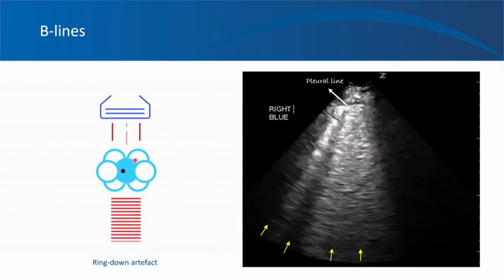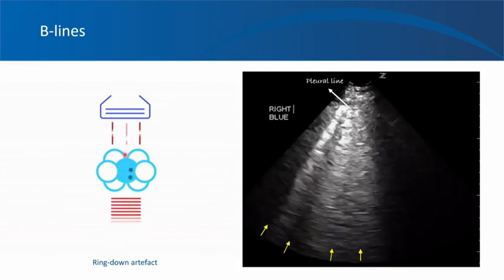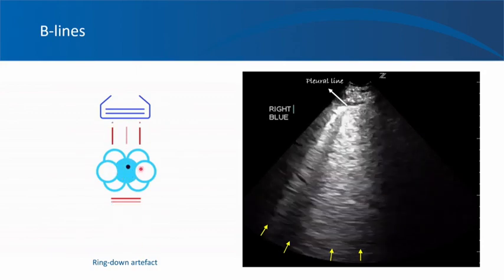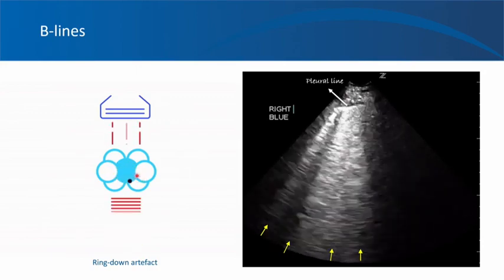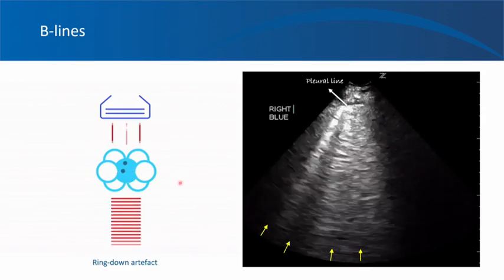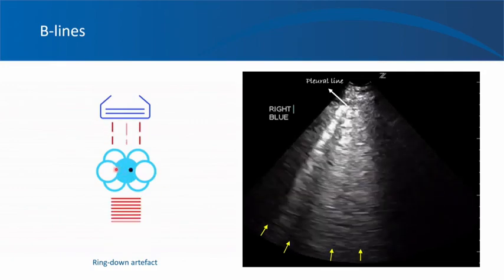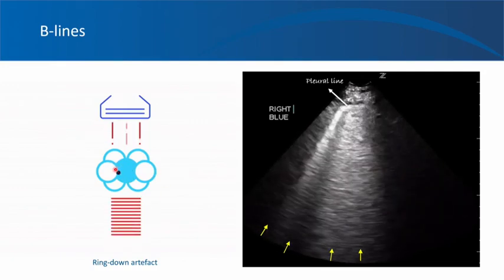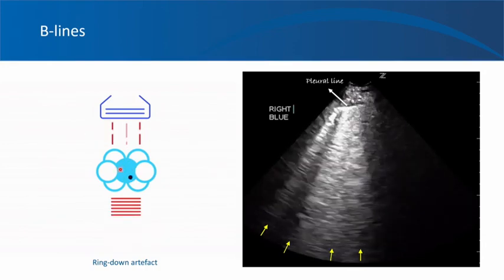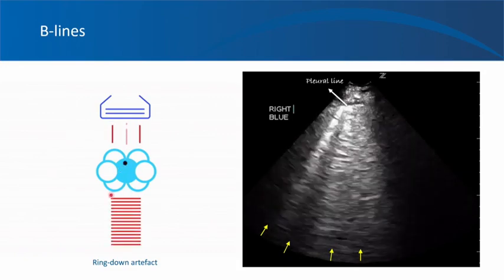That means when there is fluid in the interstitial septa of the lung that is surrounded by the alveolar air in the form of bubbles, and it forms like a tetrahedron, like the fluid stuck in between the tetrahedron formed by the gas bubbles. And when the ultrasound beam reaches these air bubbles, it is capable of exciting the liquid that is trapped in between the bubbles, and each vibration of the liquid causes a continuous source of sound that is transmitted back to the transducer, and it's represented as a line.